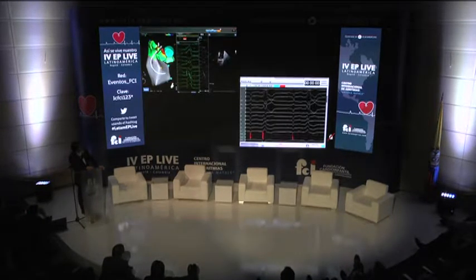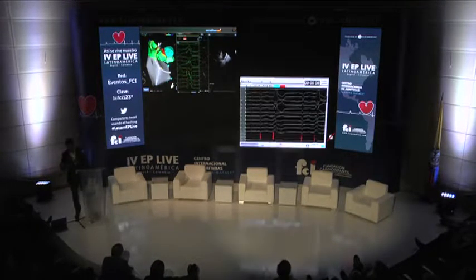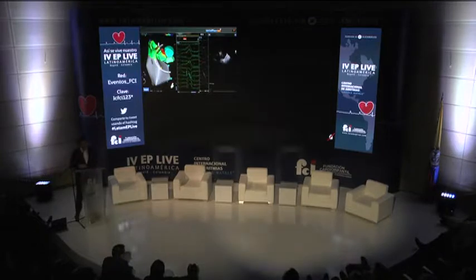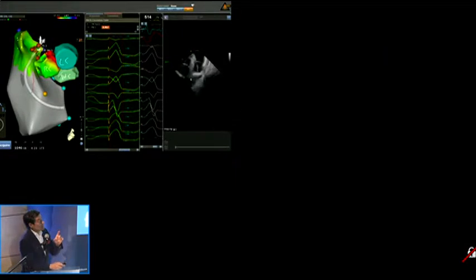Please measure the earliness here in the PRUCAP. It doesn't look as early. And we are discussing this with Andrea here. What's the earliness? Please update, Marcela. What's the activation like there, Diego?